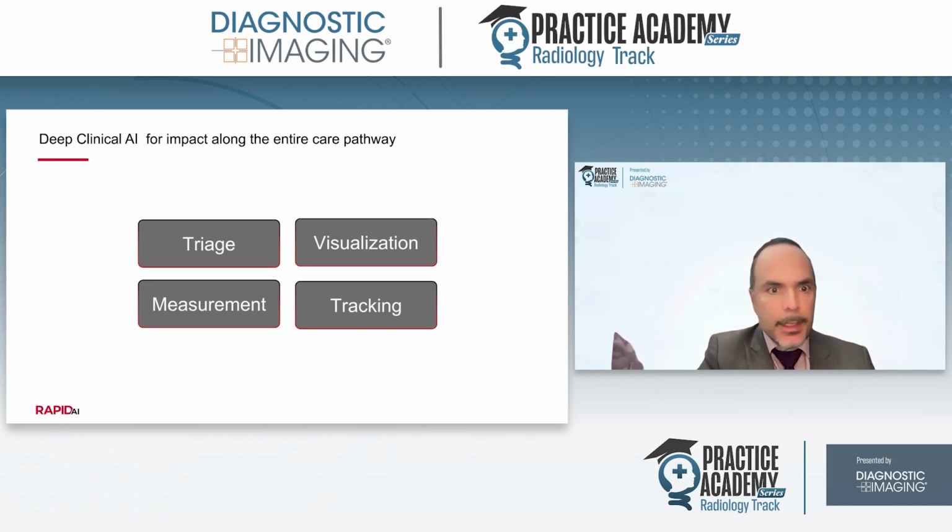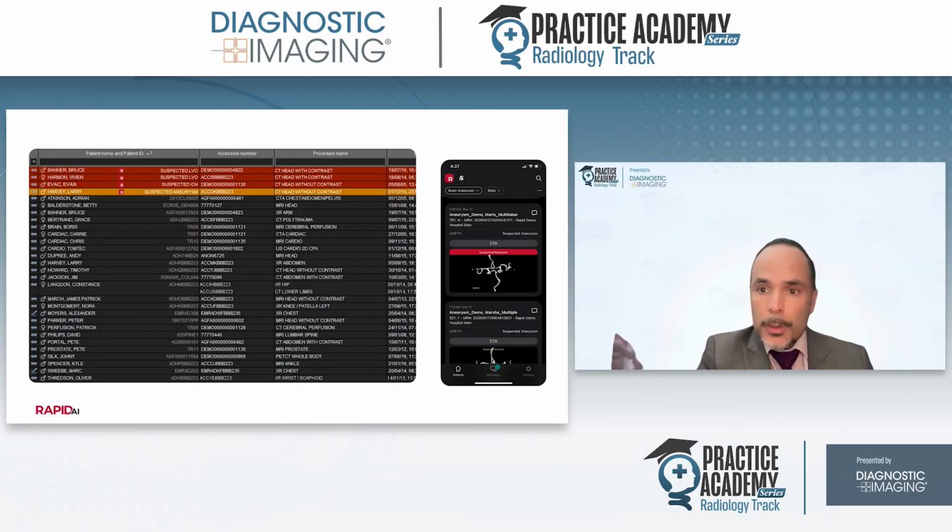And yes, I think I want to stress one particular workflow that's near and dear, and that is the aneurysm diagnostic and detection tool and prioritization workflow, which is something I think very exciting for any of us who are in neuroimaging, knowing how much time is spent in looking for aneurysms, the concerns that one might overlook an aneurysm that maybe not even for a year or 2 years, but at some point down the line may present a massive complication for a patient. And this is a major development, I think, in Rapid's portfolio.